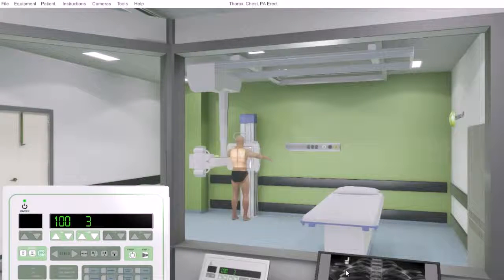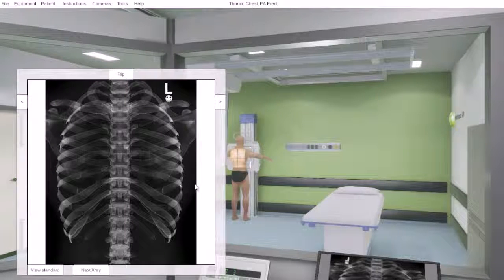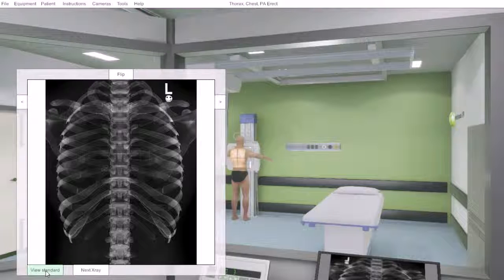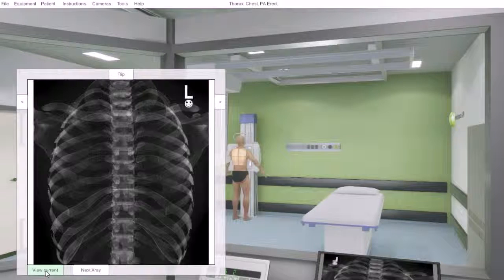The student will then have a virtual image of the exact positioning and technical factors employed, and they have the ability to compare this with a pre-set technical standard that has been set by their administrator. And that concludes this tutorial.